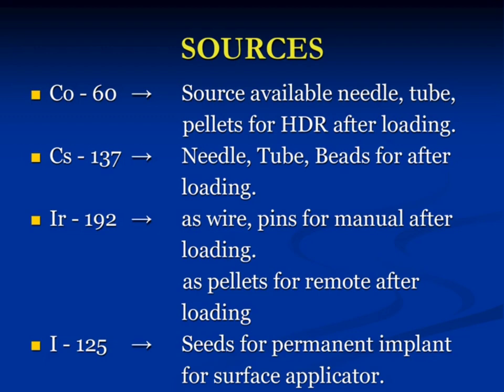You can see here the source and how it is built. Basically, there are retaining spacers, then active spacer beads, and then the actual source.